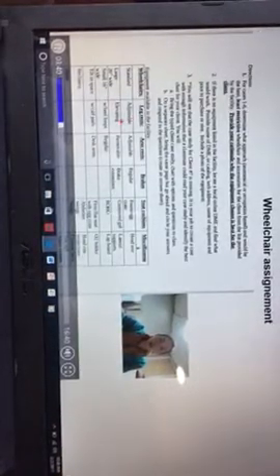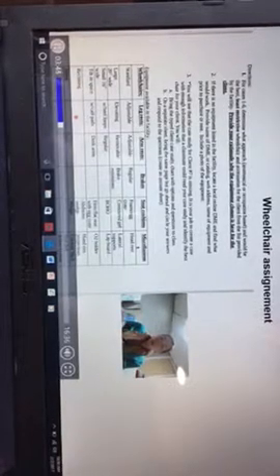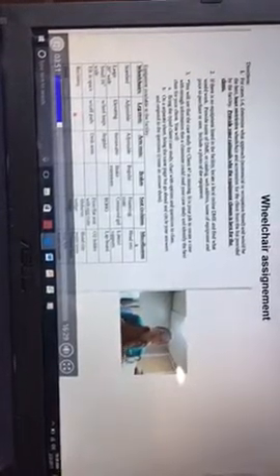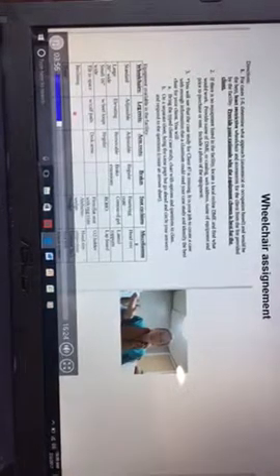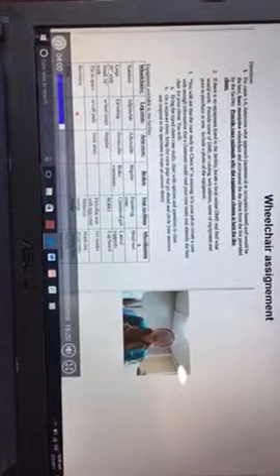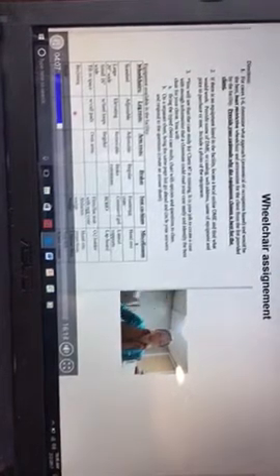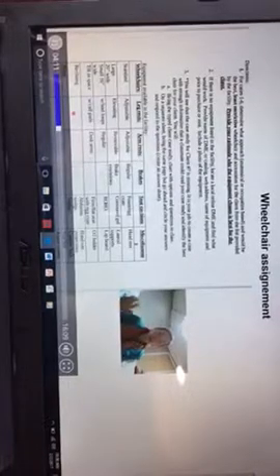The leg rest, make sure that you recognize that it's adjustable, it can be lengthwise, which is pretty important. Elevating is really important. Just think about as your legs are elevating, if you have an elevating leg rest, you almost always want to make sure that they have heel loops and calf pads, because if you elevate that leg and you don't have a calf pad or a heel loop, that foot's going to fall right off of the foot pad.